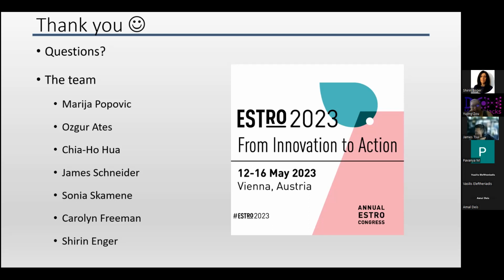Sammy said very interesting, there are also other techniques of segmentation, such as thresholding, edge-based, active contour models. Again, I don't reinvent the wheel. You said it right. There are so many techniques for segmentation, so much that's already out there. Use the simplest, apply it, check if it works. At the end of the day, these are not clinically validated, so you still need to check it.